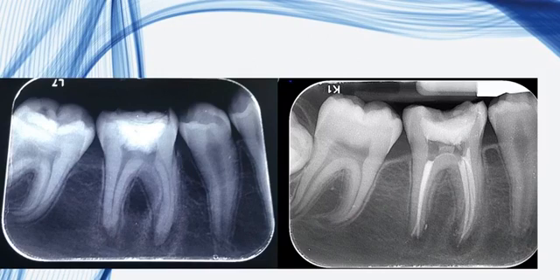We have small preparations, narrow canals, but sometimes I like to over prepare a little bit, over instrument 1 millimeter over the apex just to clean a little bit and to widen my apex size. So sometimes you can have variations with your master cone. That's why you have to fit the cone and take x-rays for that. You can see the preparation.